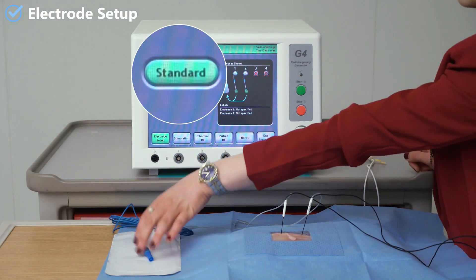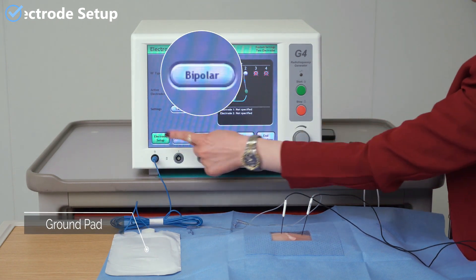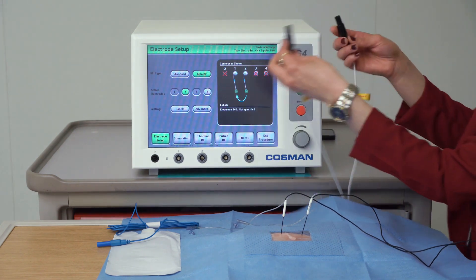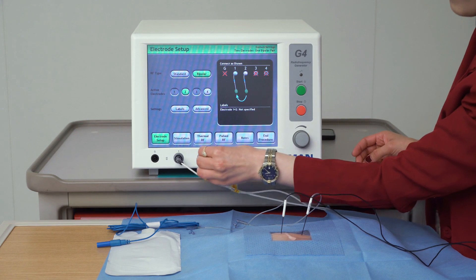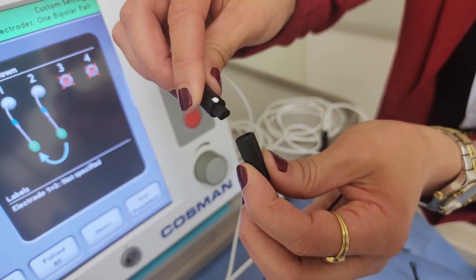Coming to electrode setup, there are two modes: the standard, where we have to connect the ground pad, and the other one is the bipolar, for which you don't have to connect the ground pad. Connect the electrode cables to the RF generator as shown in the picture, and then connect the cables to the needles.